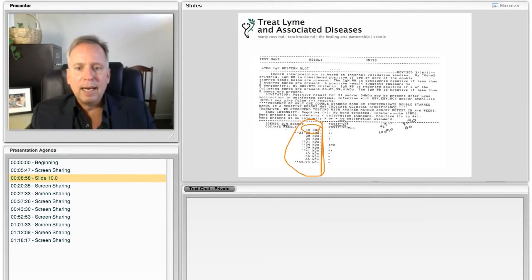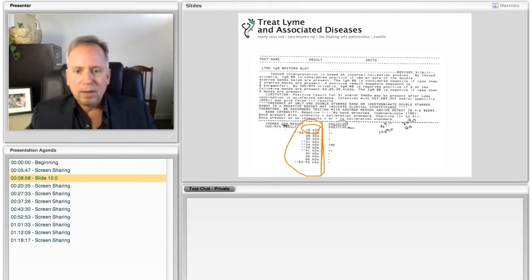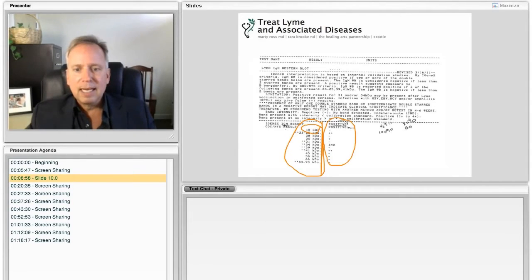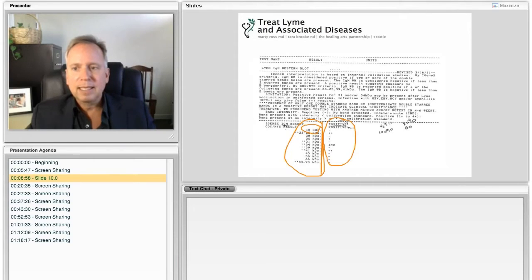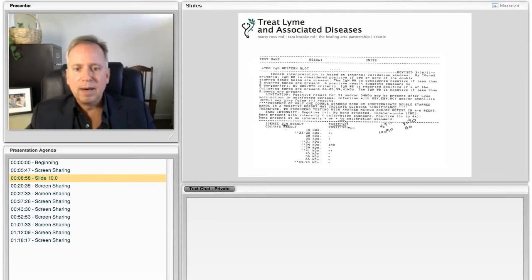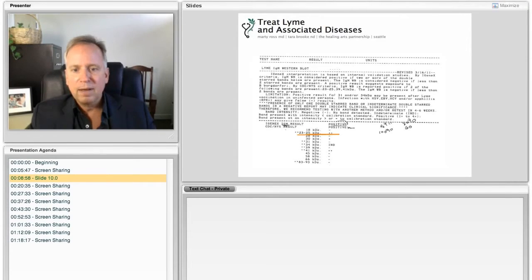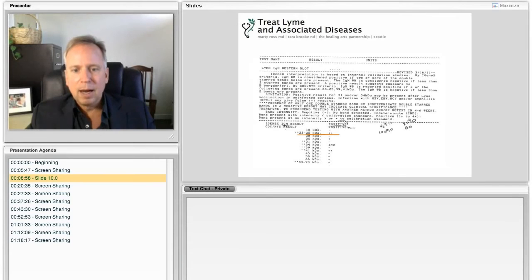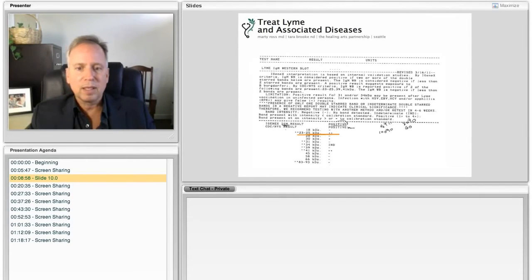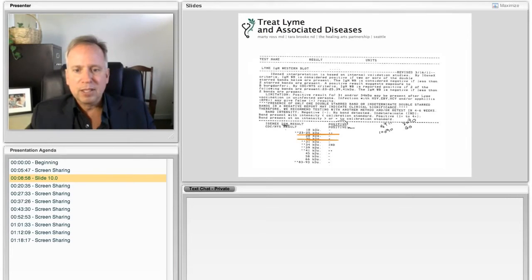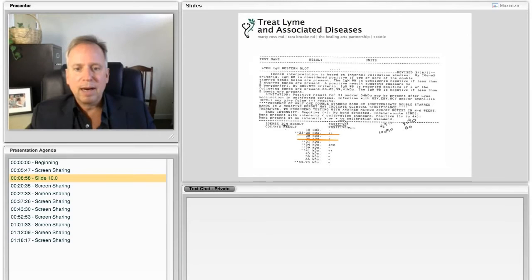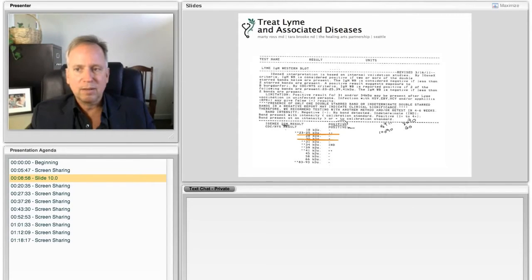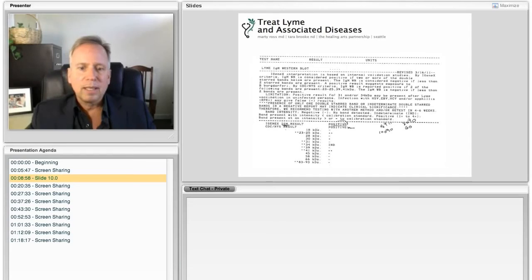And then this side over here, this second side that I'm circling now says, did this person have an antibody against that protein? So, for instance, this line right here, this 23-25, this person has antibodies against the protein 23-25. That's what the pluses mean. And also here at this position 30, there is a plus, meaning the person has antibodies against this protein 30. Now, here's how we interpret these.